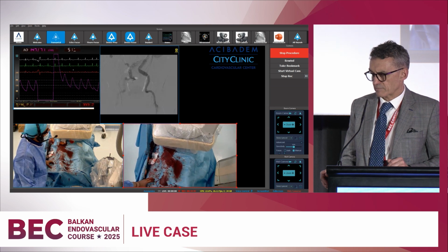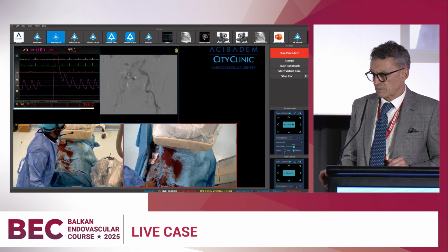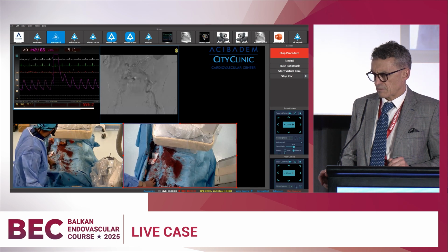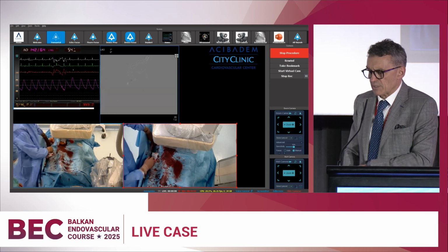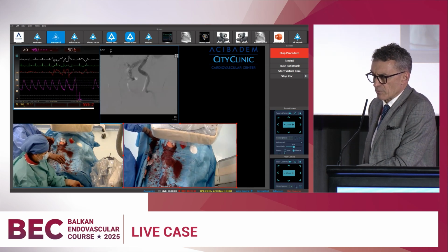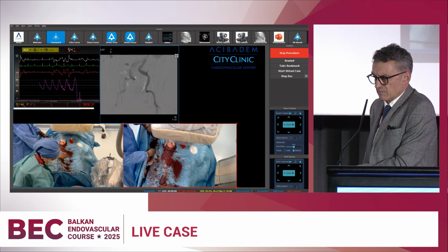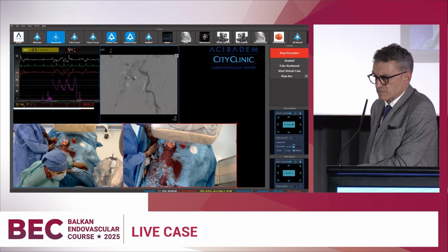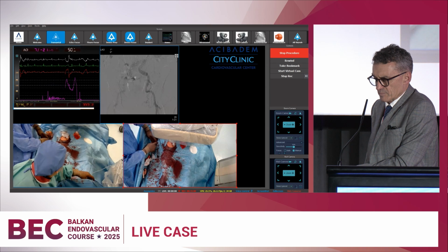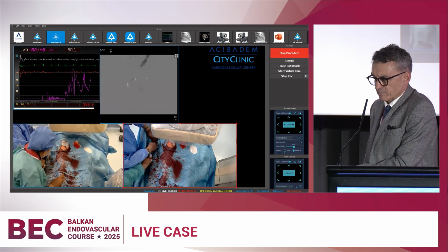It's very good. You can do one more, several centimeters more distally to the femoral. Yes. But I see most probably everything is fine. Yes. And with 5 milliliters of contrast more.